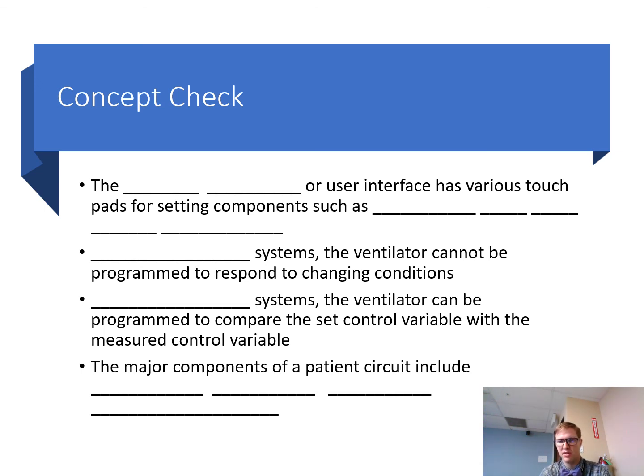So that's something that we'll look at there. And most of these ventilators will have some sort of HEPA filtering system, so when the patient exhales, if they have some sort of airborne disease going on, that could actually help protect the providers in the room.